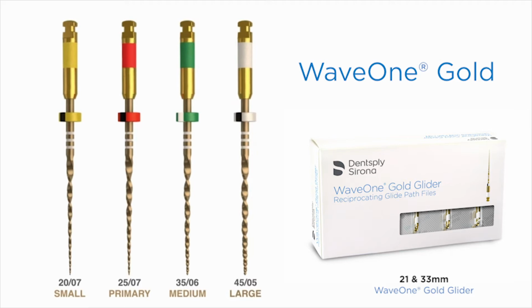With experience sometimes, and based on a preoperative film that reveals a large system, one might, after a glide path, select the medium file, for example. But generally, I want to keep repeating, it's the primary file that's usually the first file into any particular system. So let's talk a little bit about why one might need another file, either smaller or larger, in the range of anatomical cases that we see on a daily basis.